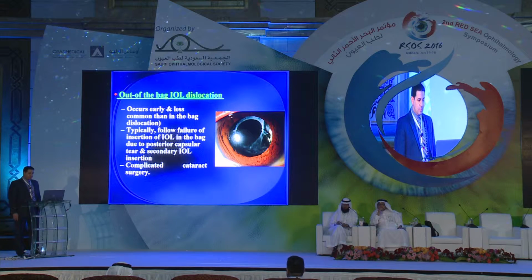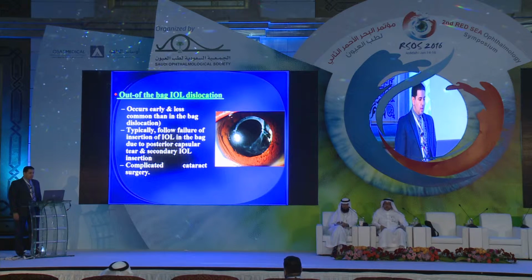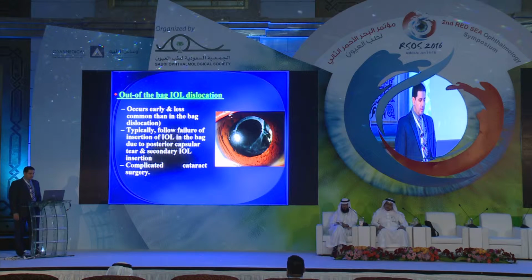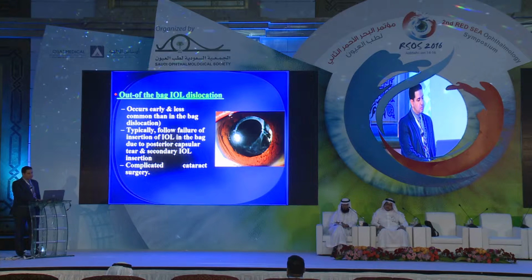Out-of-the-bag dislocation occurs early and is less common than in-the-bag dislocation. It typically follows failure of insertion of the IOL in the bag due to capsular tear and secondary IOL insertion. This is almost always in complicated cataract surgery.